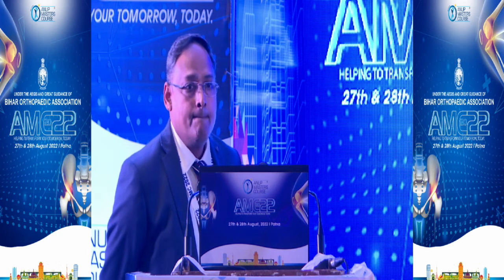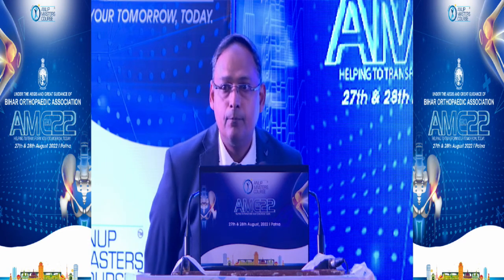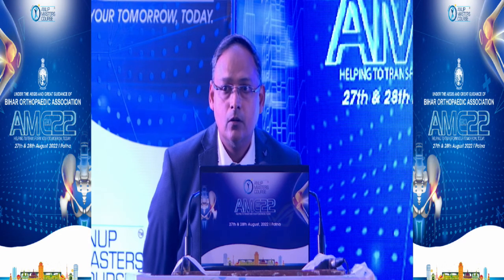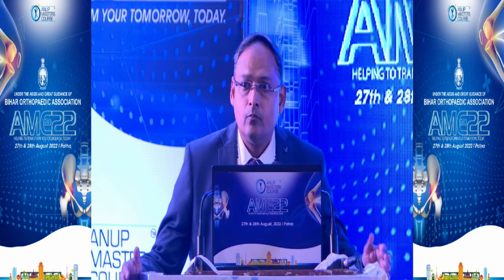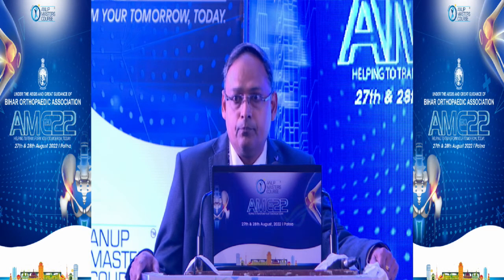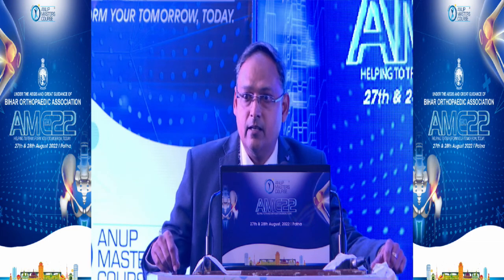Hello, Dr. Sanjeev, it's Dr. Arvind. You said bone graft is not very good at taking care of the shear forces. But anyway, you are using the stem there. Absolutely, along with the plate. So in that case, if the bone graft incorporates, it lasts throughout the life of the patient. That is not going to be given by your metallic wedge. Yes, it is definitely useful to use a longer stem on the femoral side. Both, either femoral or tibia.